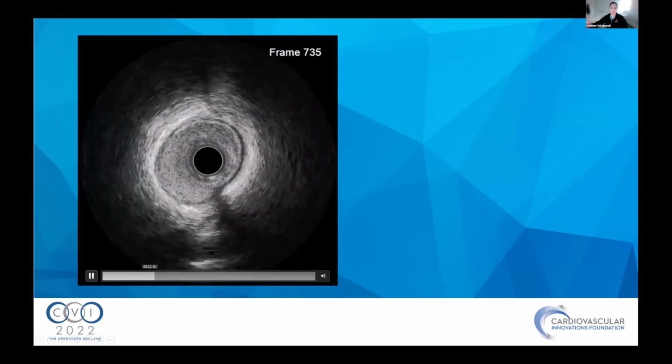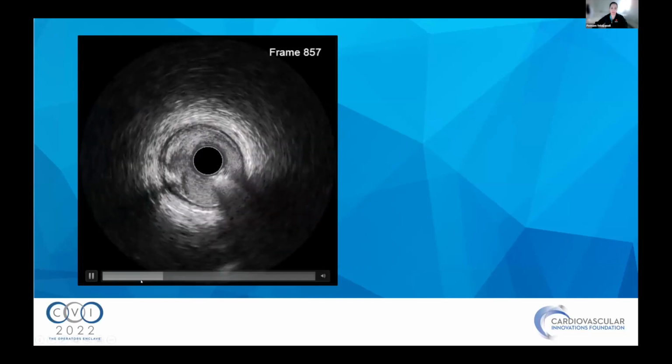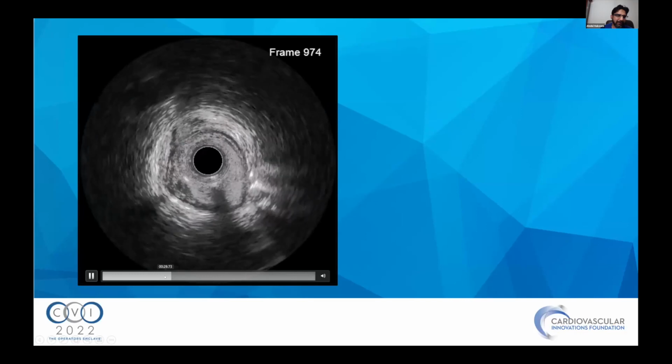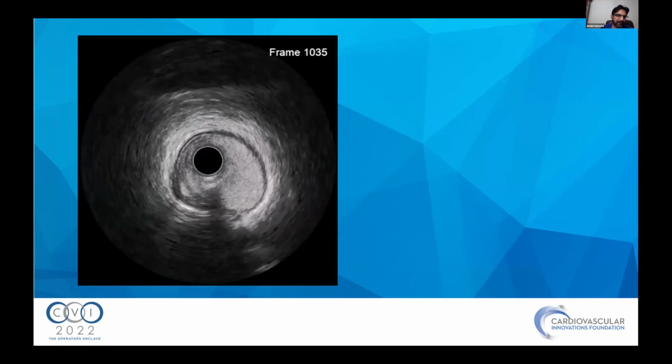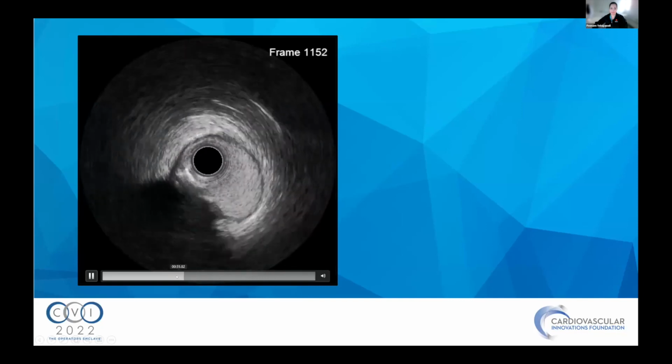Well, in the meantime, we had already pulled the stents and everything, and we were getting ready to put the stent in, but I just wanted to see if there was any major perf or anything. It was just out of proportion to what I thought had happened. So.